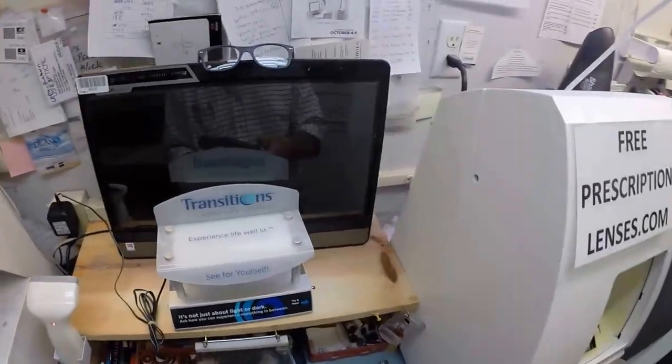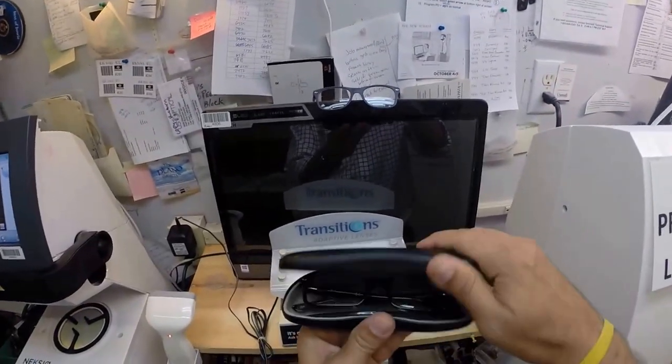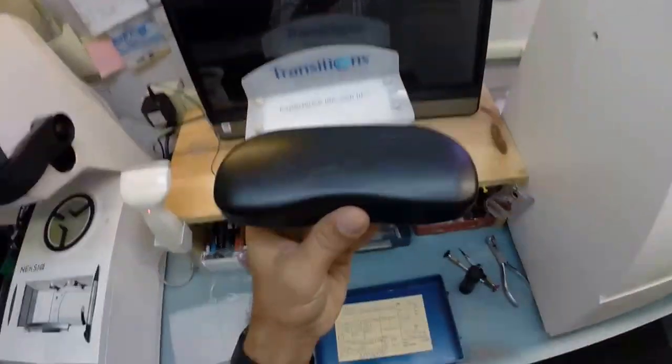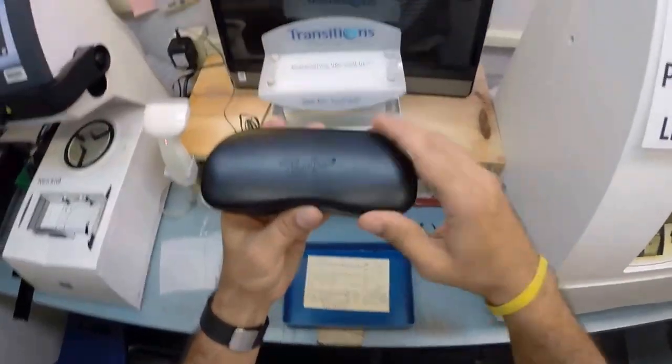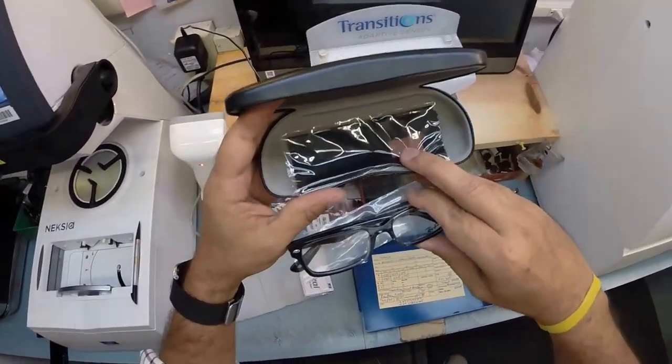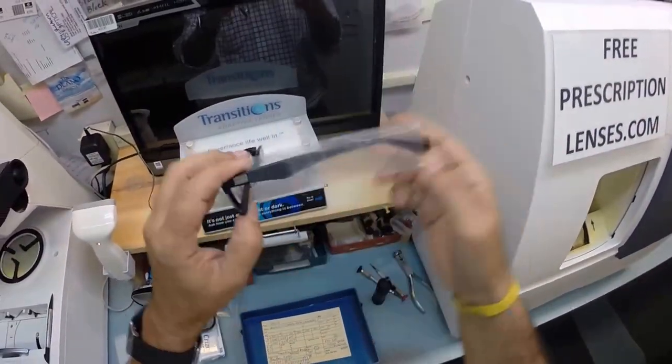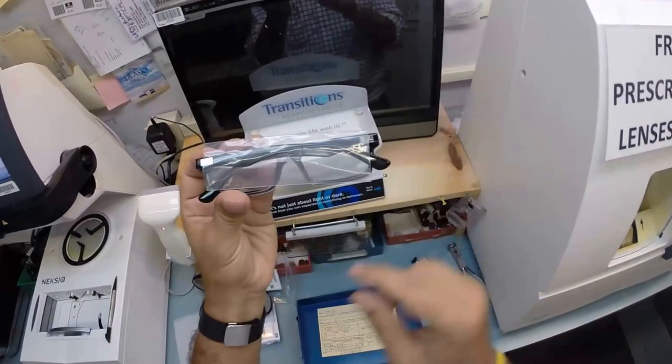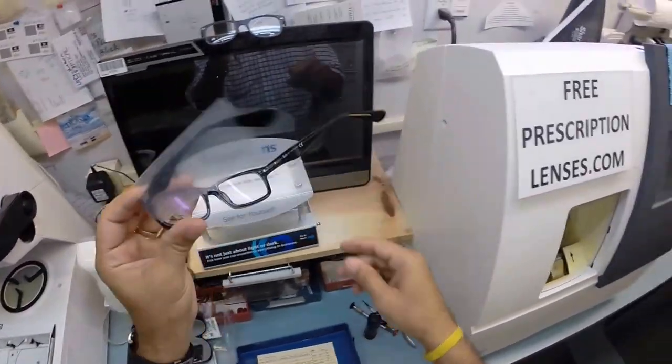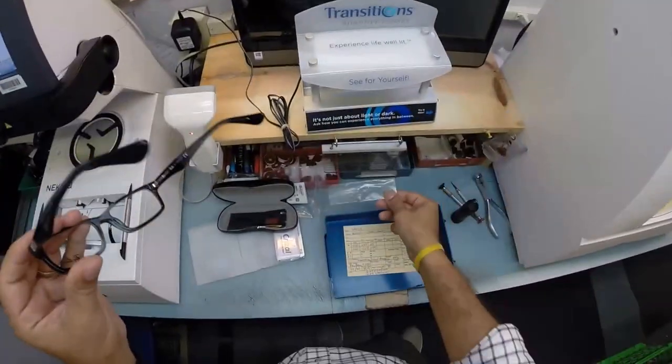I'm going to take everything out of the original packaging as it comes to me. Your hard shell clam shell case, your Ray-Ban cleaning cloth, and your Ray-Ban frame which comes with a little plastic sleeve on the left temple to protect the temples from rubbing together while it's being shipped. I will keep that on there when I ship to you, but I'm going to take it off for now.